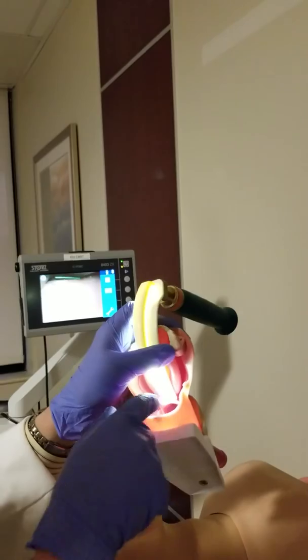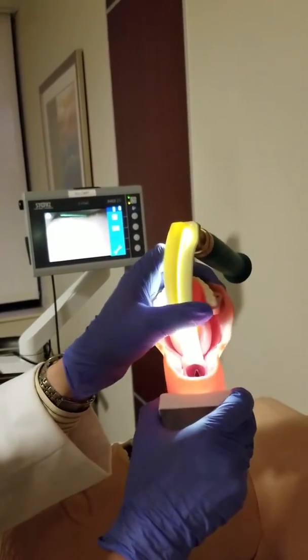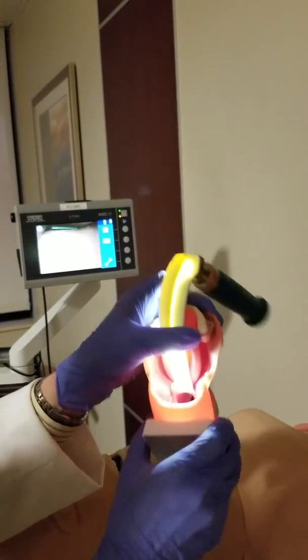So that's the glottis and the cords — you can see them in there. This lifting upward, you can see what it does to the epiglottis: it lifts it up to create more space.